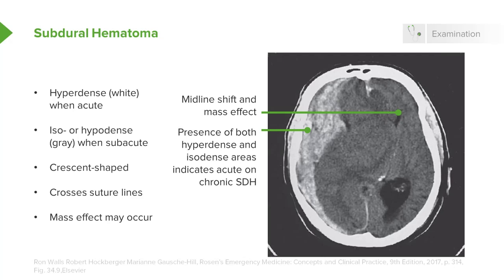You may see mass effect in this case. The image shown here is a very large, dramatic subdural hematoma. You can see both bright white hyperdense blood as well as more gray isodense blood, suggesting acute on chronic bleeding — blood of different ages in this collection, meaning the patient has probably had it for some time. There is significant mass effect and midline shift, with the midline bowed all the way over to the contralateral side, and effacement of the ventricles. This is a large and very dangerous subdural hematoma.